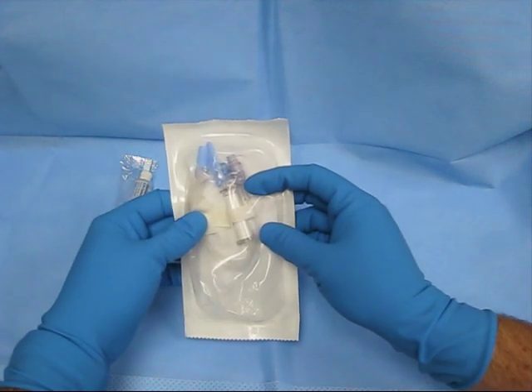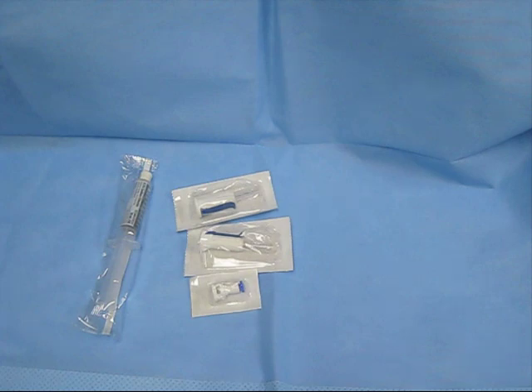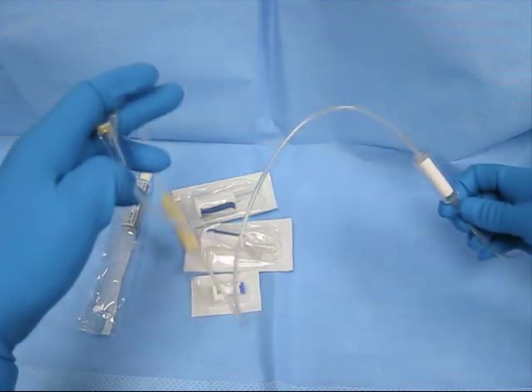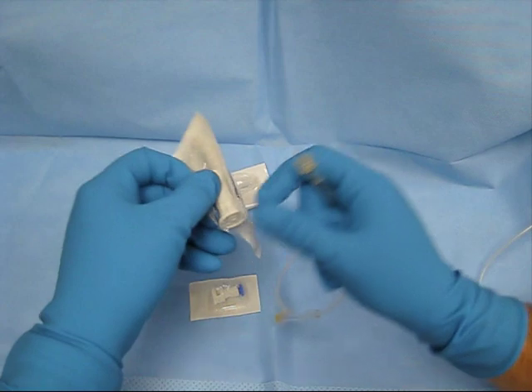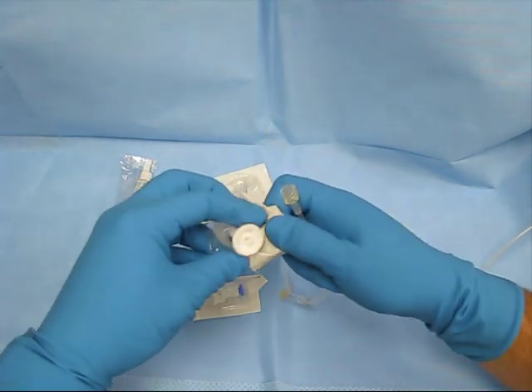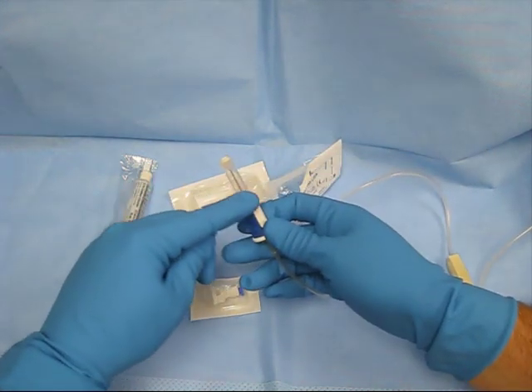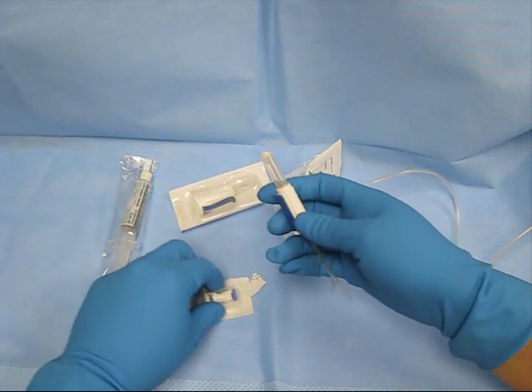Go ahead and hook this Pall filter up to your primary IV tubing, connect a bag of normal saline to your primary tubing, and run it through so that your Pall filter and your IV tubing are all connected. Then open up one of these face seal needles and connect your IV tubing into here. Go ahead and run some through until you see it primed.